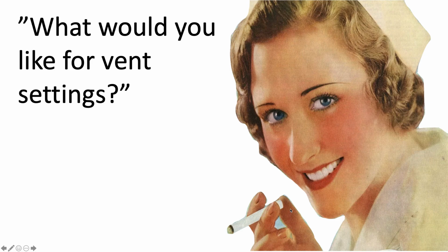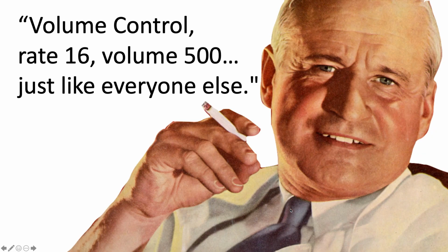So someone's going to ask you, what would you like for your settings? And first off, we can't just look at them back with a scared face, and we also can't just say, oh, let's do the cookie cutter. Let's do what everyone else does for every other patient, because not all patients are the same, and not all physiology and disease states are the same. So we need to have a more organized and structured approach to this.